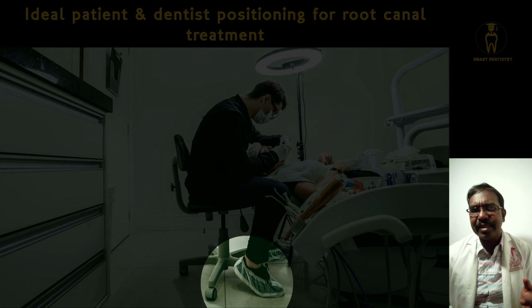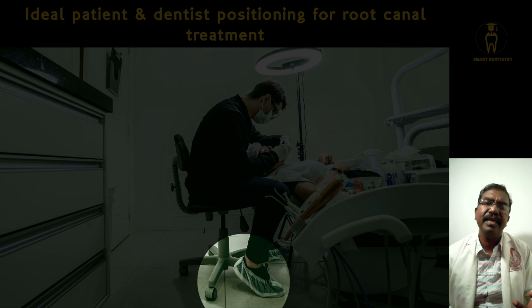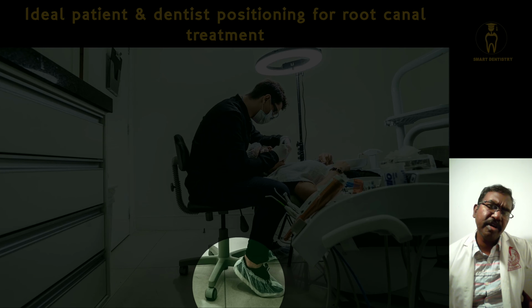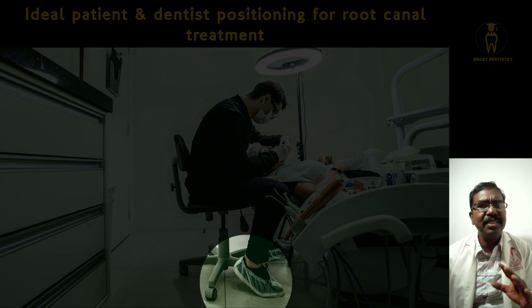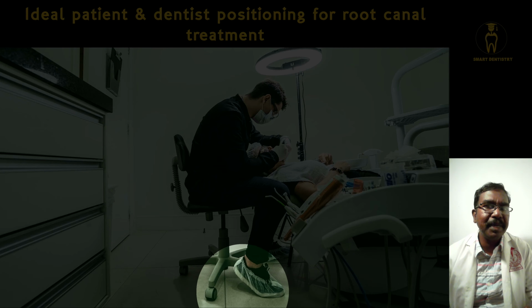By doing this, it will prevent unnecessary overload on the spinal cord. Most dentists have back pain, neck pain or shoulder pain. Most of these are because of improper patient and dentist positioning. This is often overlooked, but it is very essential that we have the foot properly placed on the floor.